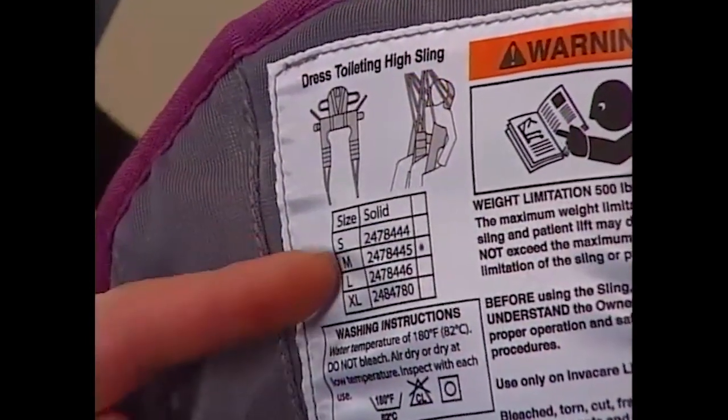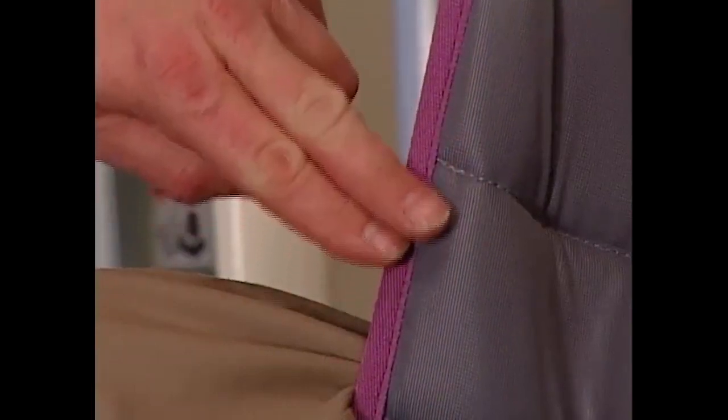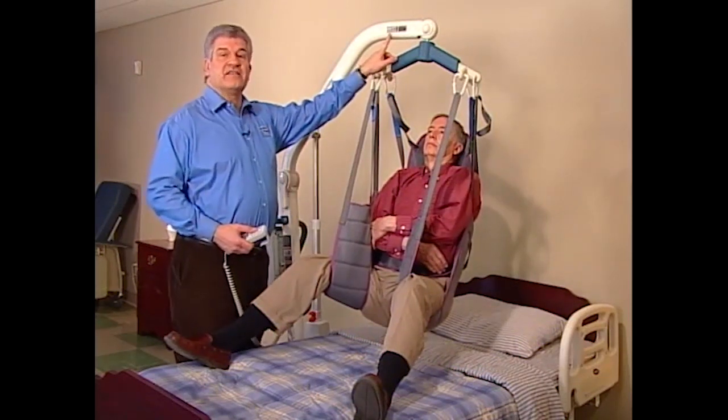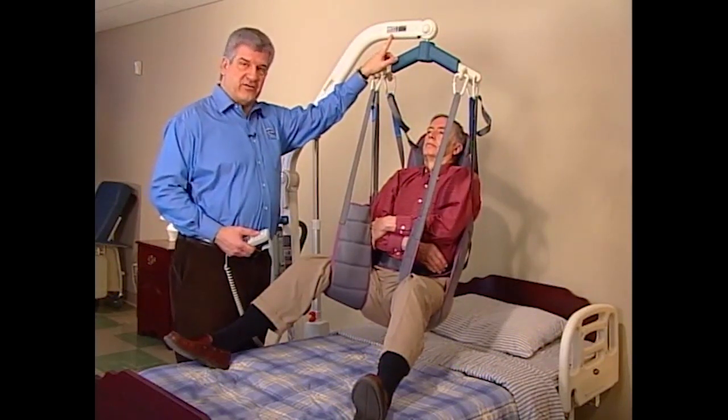Sizes are indicated on the labels and by the outer binding color; refer to the sling chart for dimensions. Check the weight capacity of the lift and sling. Do not exceed the lowest weight capacity of either item.